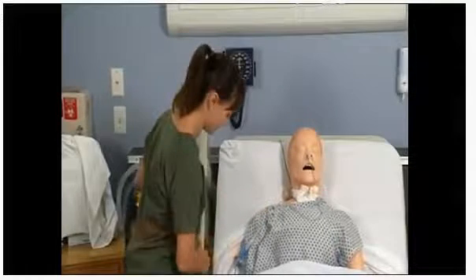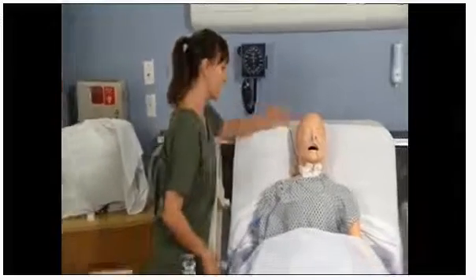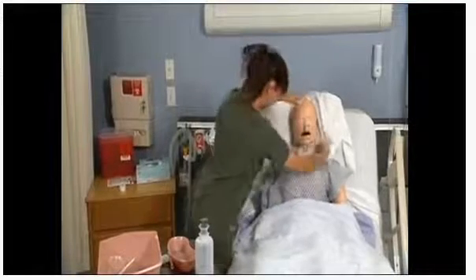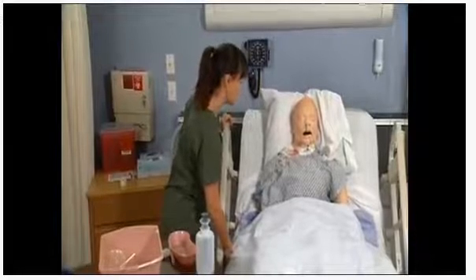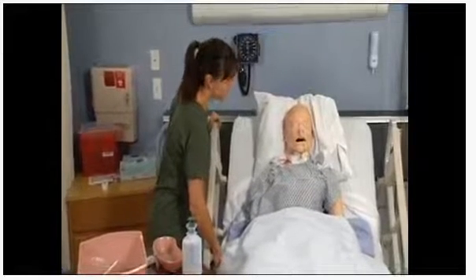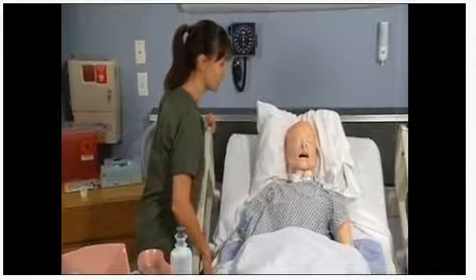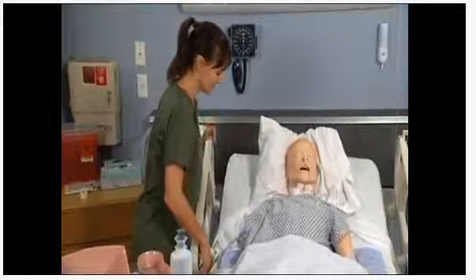How do you feel? I want to go ahead and put up my side rail. Would you like the pillow back behind your head? Can you raise your head for me? Mrs. Jones, I want to make sure that you understand a few things. Don't ever lay down flat. You need to be at least about a 30-degree angle at all times. If you start feeling that you're becoming nauseated or vomiting, you need to make sure that you call me and let me know, okay?